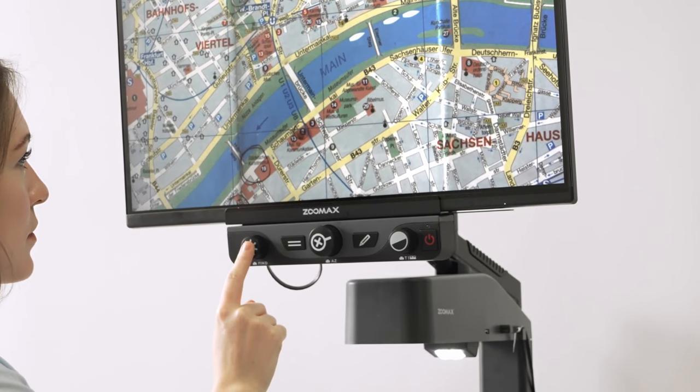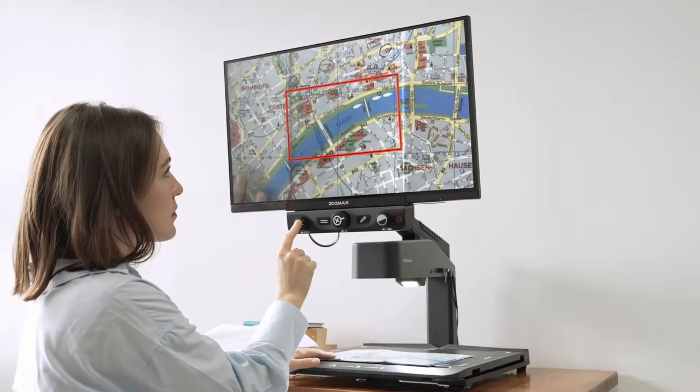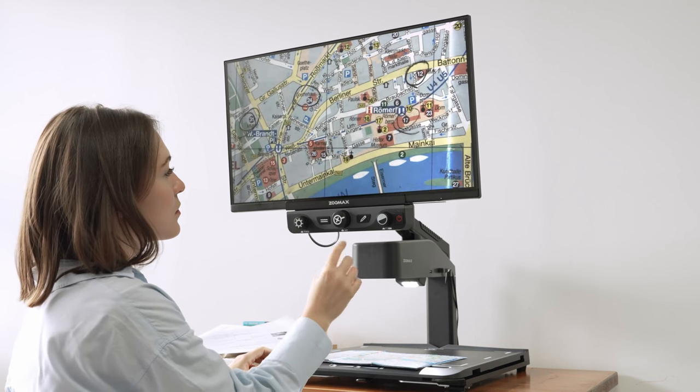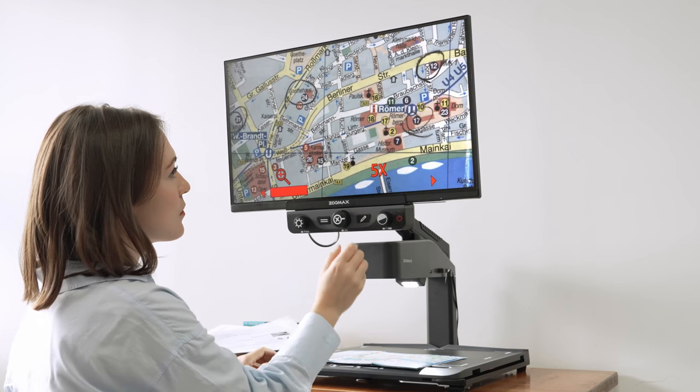The Find Function is recommended if you want to close in on a particular area. Press the brightness button, and a red highlighted frame appears on the display. Put whatever area of the image you want to see inside the red frame, then release the brightness button. The Find Function helps you locate the area you want to read.